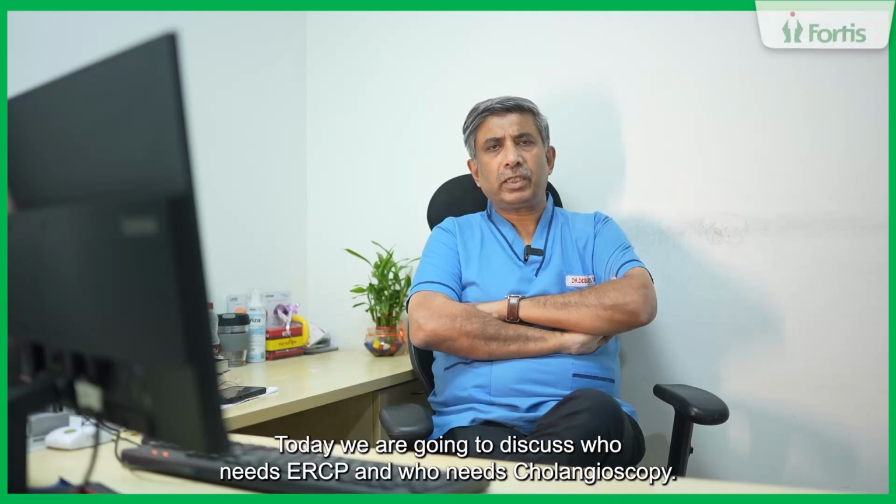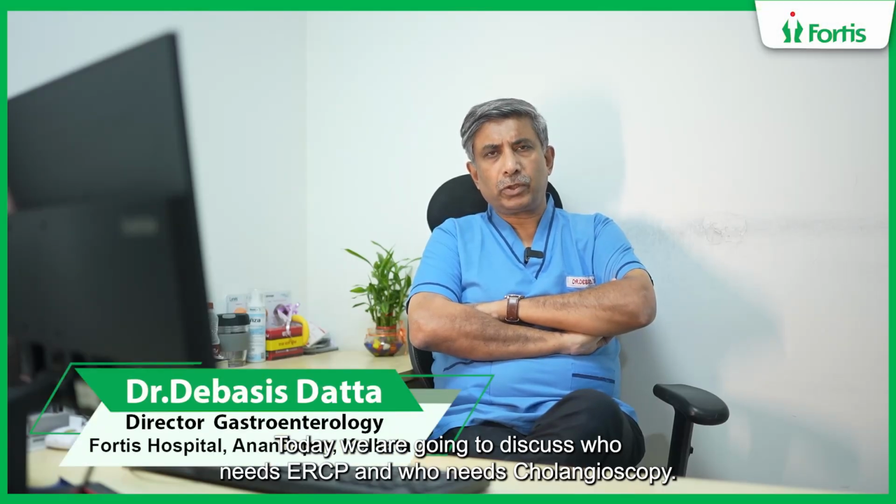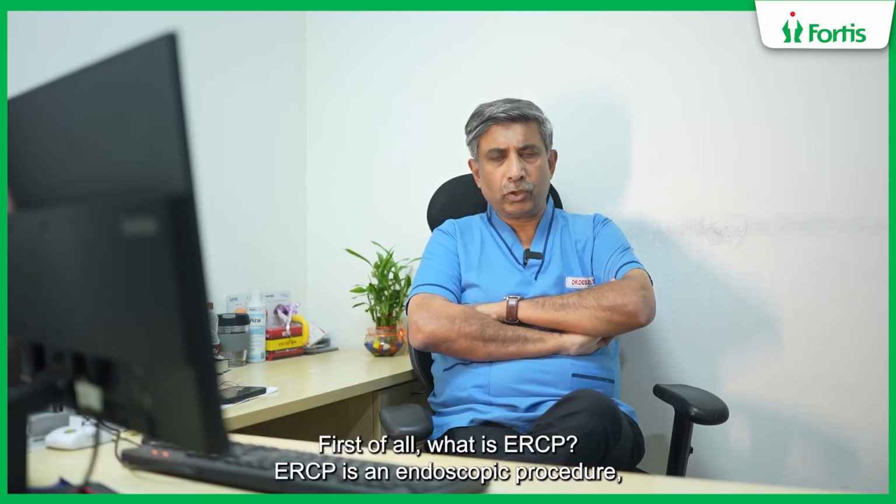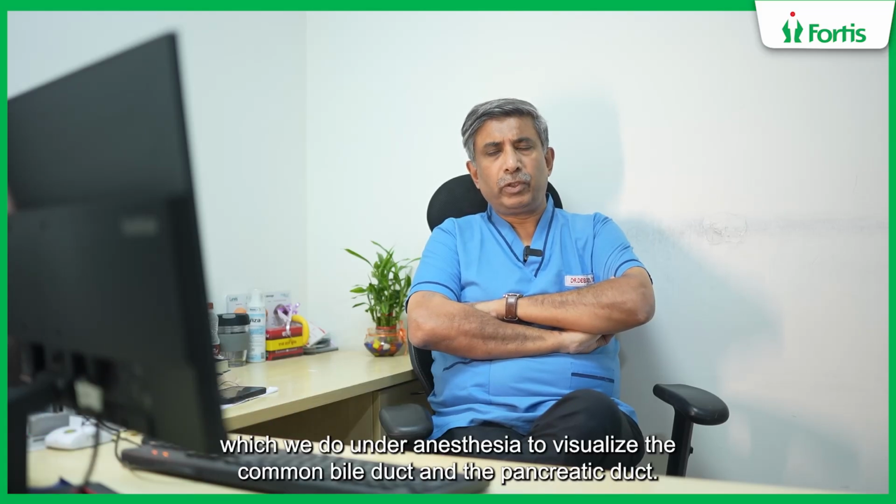Today we are going to discuss who needs ERCP and who needs cholangioscopy. First of all, what is ERCP? ERCP is an endoscopic procedure which we do under anesthesia to visualize the common bile duct and the pancreatic duct.